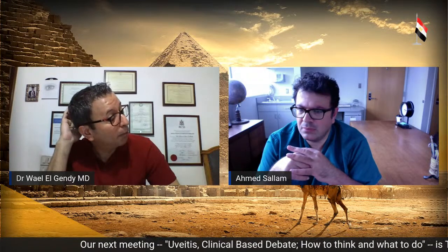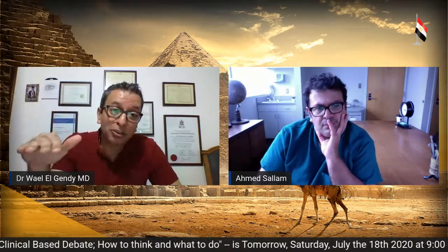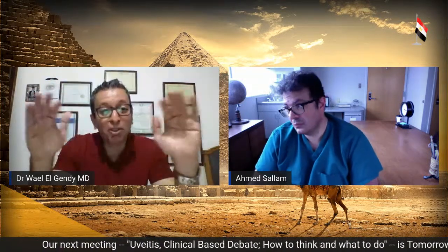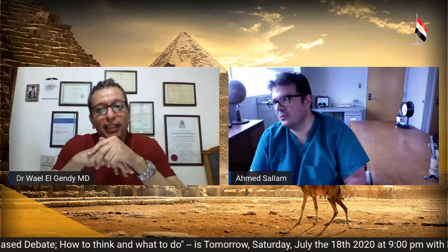Okay. Well, I did that a couple of times. One time it was good. The other time was a giant retinal tear surgery that went completely nice, a very nice surgery. After I did the laser, as I overfilled with the PFC and did my laser, everything was fine. And I was like, you know what? I'm not going to do any exchange. I'm so happy with this result. I'm going to leave it. And I left the patient on PFC.